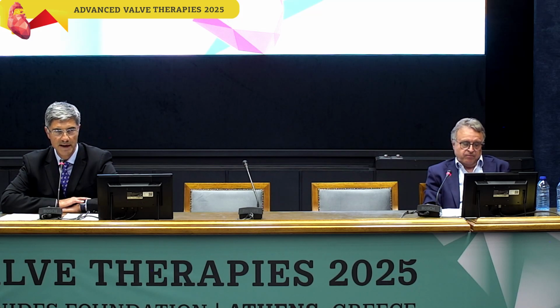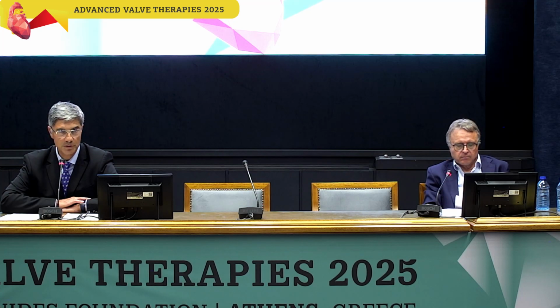It was heavily calcified, as you could see in the initial 3D. So we expected in the initial procedure to have some leak, but we did pre-dilatation. We were really modest because we were aware of the calcification extending to the LVOT, and we were afraid to disrupt the annulus. And this case is very similar to the case that Dr. Pilates showed us yesterday. He had a similar expansion of the pre-dilatation balloon. The left cusp was never properly approached by the balloon.